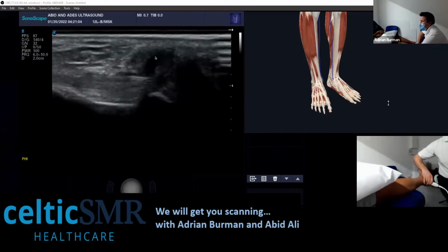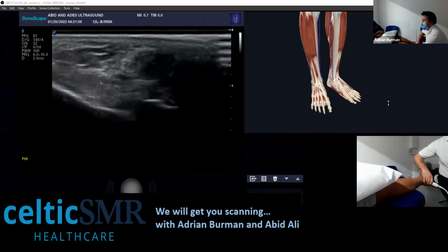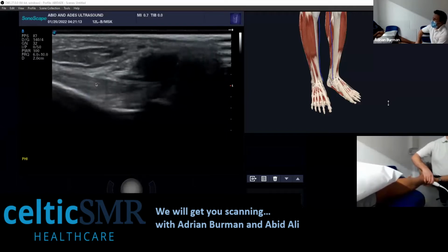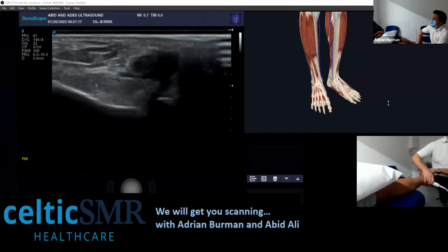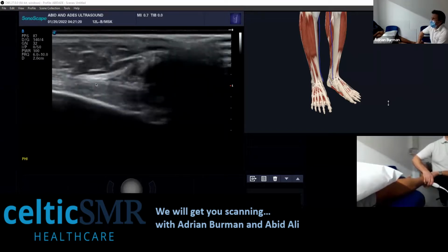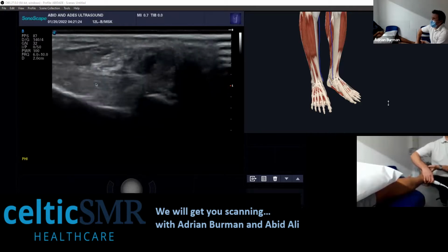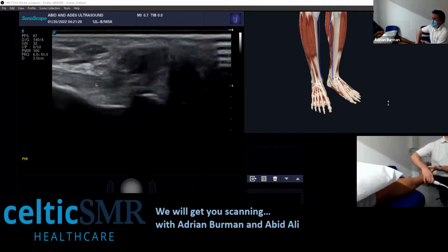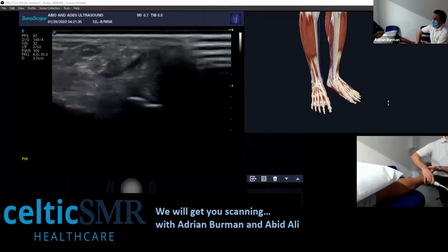These are the peroneal tendons. There's your CFL. It's like a hammer kick, underneath the peroneals. So you dorsiflex up, and then plantarflex down. See how it loses tension. They drop, dorsiflex up, and they springboard up. There's your peroneals there, along with your CFL, where the arrow is. Nice lineage. Does that help?